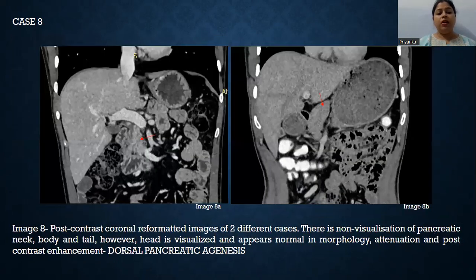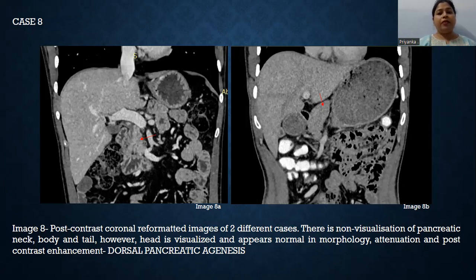The next case demonstrates dorsal pancreatic agenesis. Post-contrast coronal reformatted images of two different cases show non-visualization of the pancreatic neck, body, and tail. However, the head is visualized and appears normal in morphology, attenuation, and post-contrast enhancement.